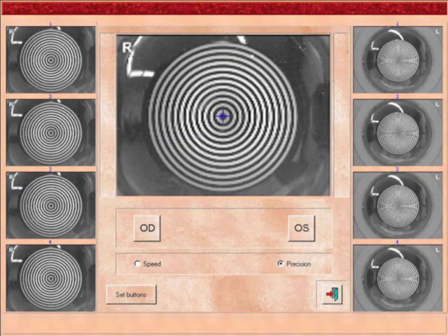Okay. Well, in the mid-1980s, J. James Rowsey at the University of South Florida had an idea that was very clever. These images are not his, but they're a good way to think of things. He photographed a bunch of little steel spheres, just like the steel marble that we were talking about when we were looking at ourselves. And he took photokeratoscope images, and he measured, actually, of course, he didn't measure, right? He had his residents and fellows measure.